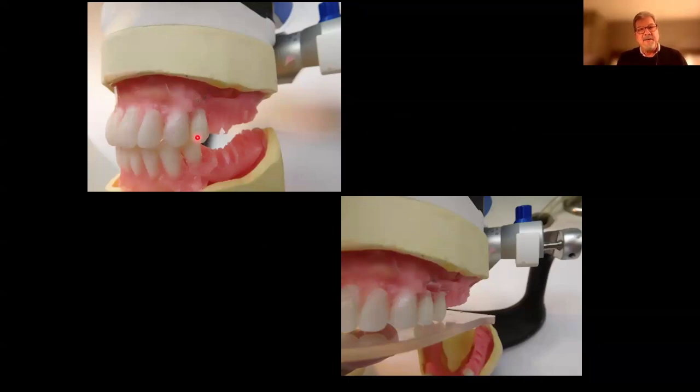So anyway, first thing I want to do is set my upper bicuspid here. Then I'm going to measure it on an occlusal plate. I'm going to put my occlusal plate in contact with the first two bicuspids on the upper, and then I'm going to interdigitate and start setting my lower teeth to fall into place with the uppers.